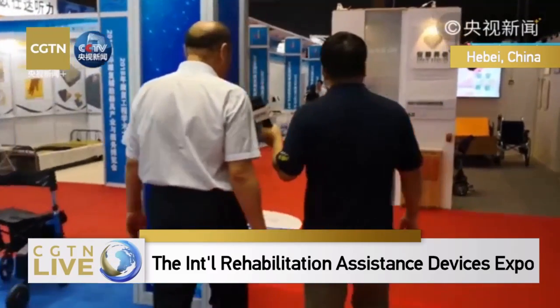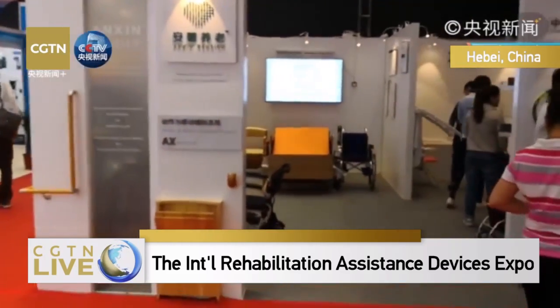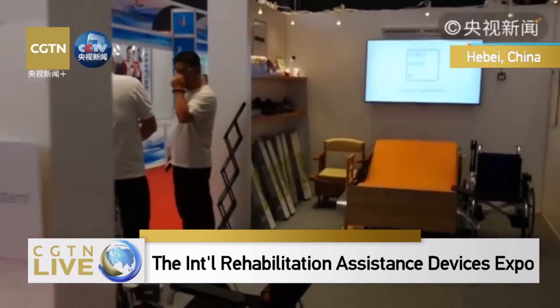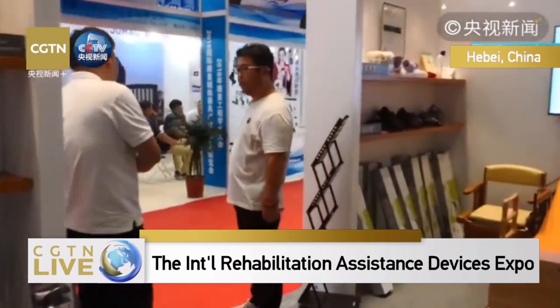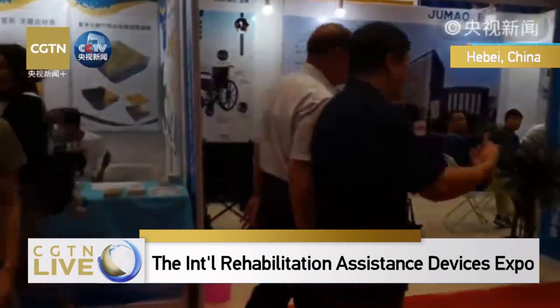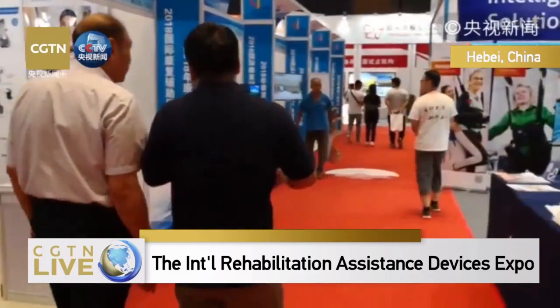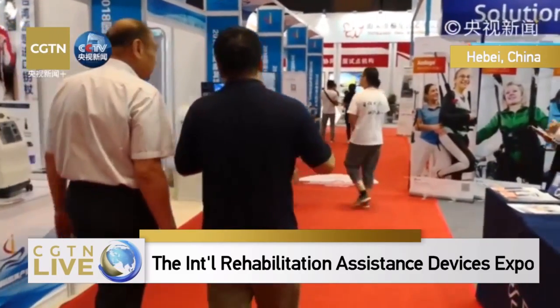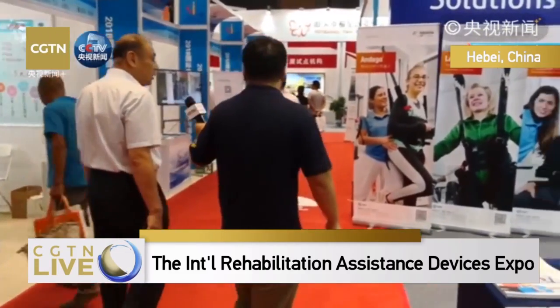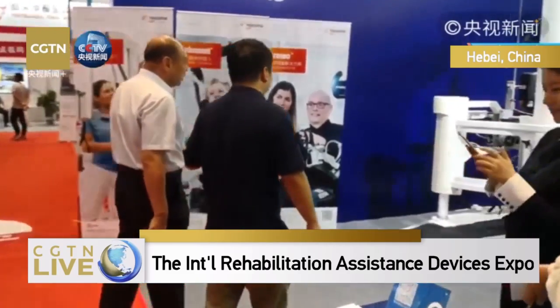The so-called smart technology is more intelligent, sometimes more intelligent than human beings. These smart devices and technologies can help someone to restore their motor functions. We did see a lot of such technologies.